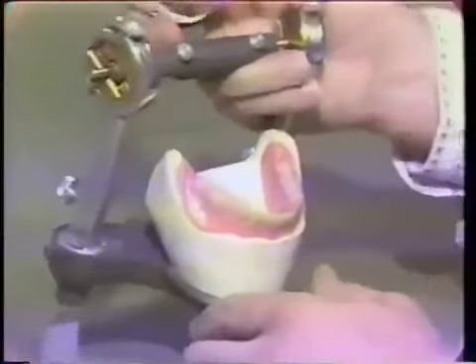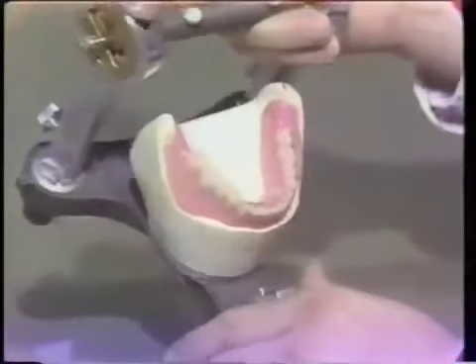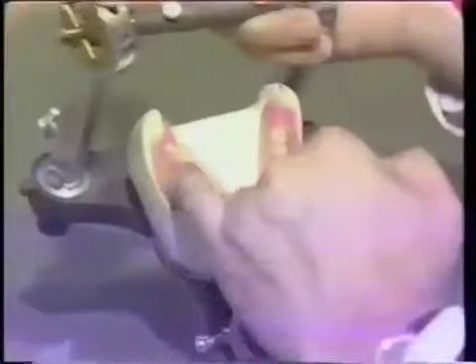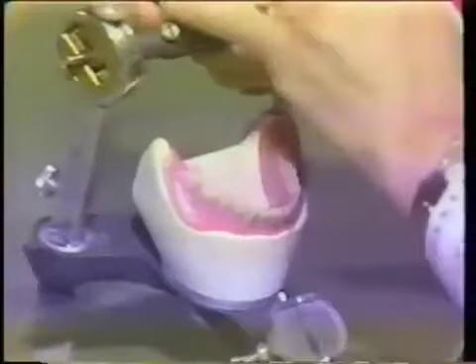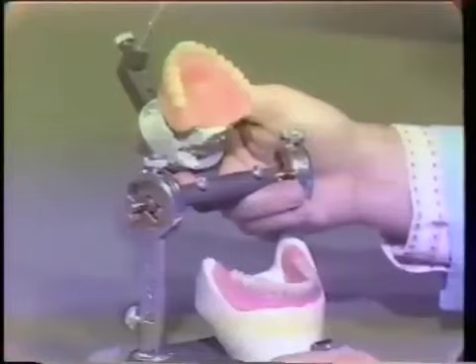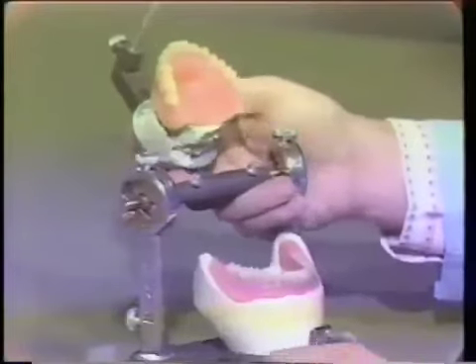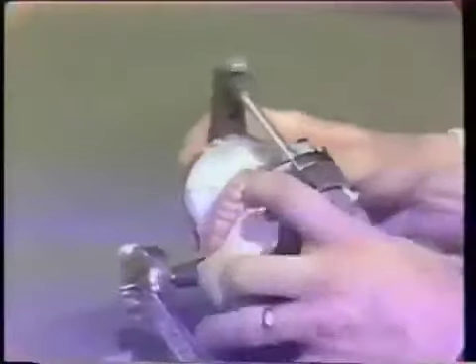It's going to be a little difficult to see on these porcelain teeth, but some teeth I'm not getting marked — for instance, the first molar, there's no mark. There's a heavy contact on this portion of the second molar. Right now I'm only grinding ridges, central grooves, marginal ridges, and possibly inclines — but not cusp tips, because we want the height of the tooth to remain for our working and balancing.